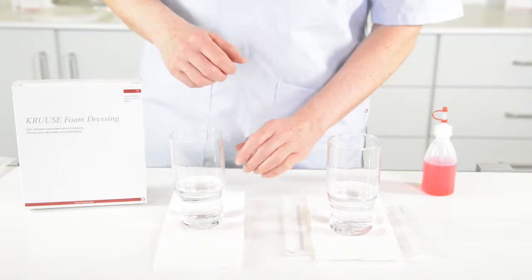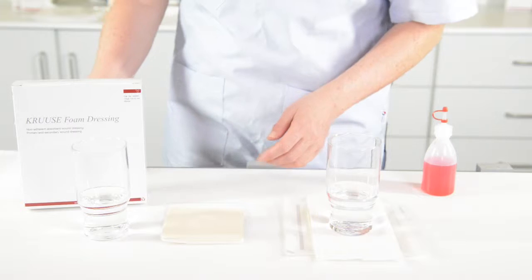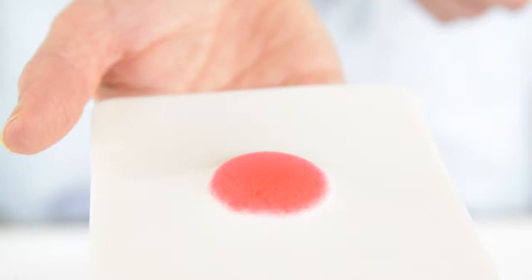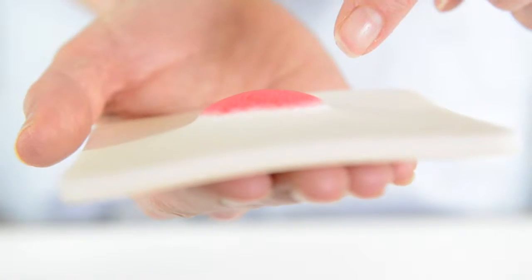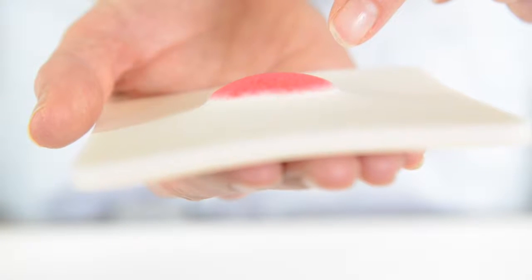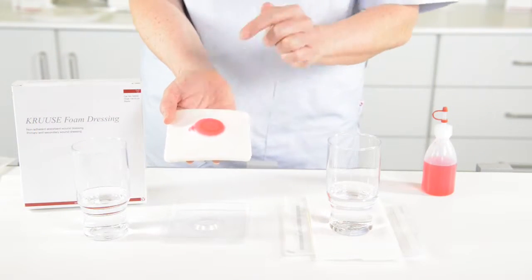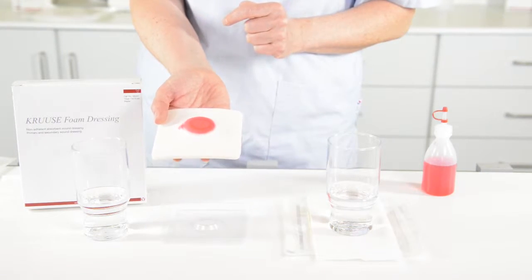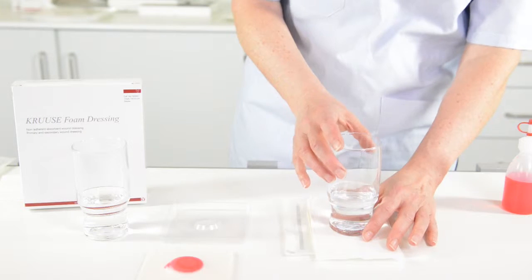Some time has passed — we can take a look. You can clearly see that there's been some water evaporating out of the backing. When I lift this one out you can also clearly see that the foam has expanded accordingly to the cavity and it's lifted up like this. Wounds are not very often completely circular, so you can see that there will be some differences in the wound.